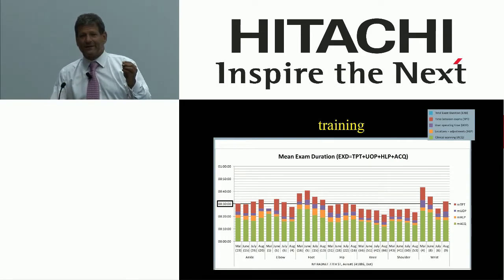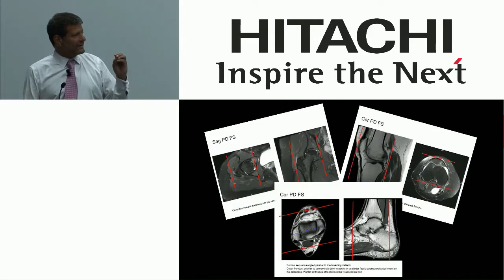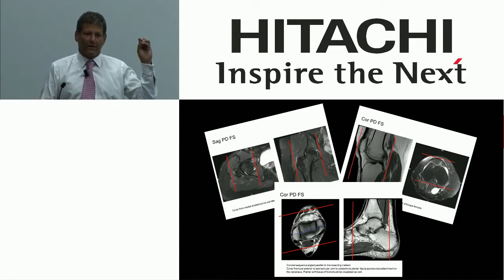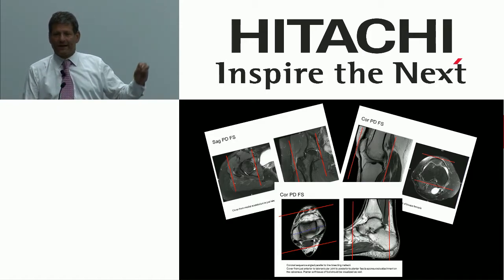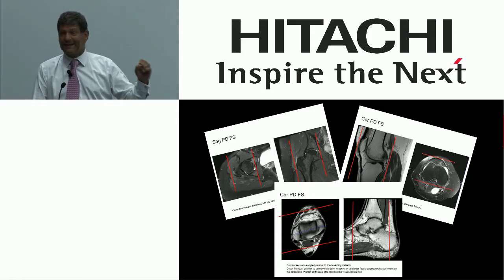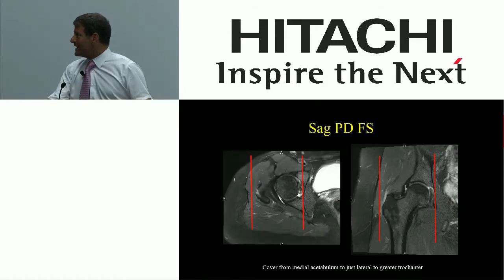The other piece on musculoskeletal, and I'm going to tell you, this is the most efficient, most cost-effective, least costly tool you can ever do, is tell your guys exactly what the coverage is supposed to be. The minute you get your guys to concentrate on the coverage, realizing that every slice costs the same, but the value is not the same on every slice, you clean up the process. The doctors stop yelling, the techs stop worrying, they stop overcovering. A technologist who is uncertain will overcover 20%, sometimes in each direction, sometimes on 6 or 7 sequences on a single exam. That is roughly 40% of the exam time with 0 value. Communication, supervision, and training makes an enormous difference.